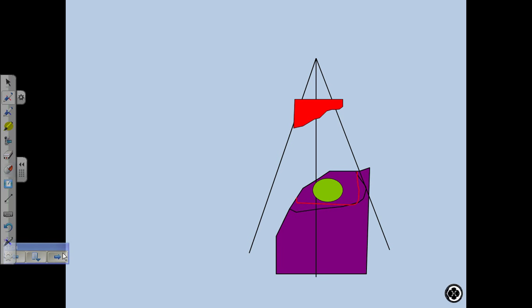Why would this be deeper? You see how this area gets a little more dose? It's deeper because there's less tissue here to attenuate. So the isodose line goes deeper here than it does up here. Well, to even that out, because we don't necessarily want to treat this deep, we'll put a compensator in the head of the machine. And this compensator is made, usually they're made to follow the patient's anatomy. Right. Have you guys seen compensators before?